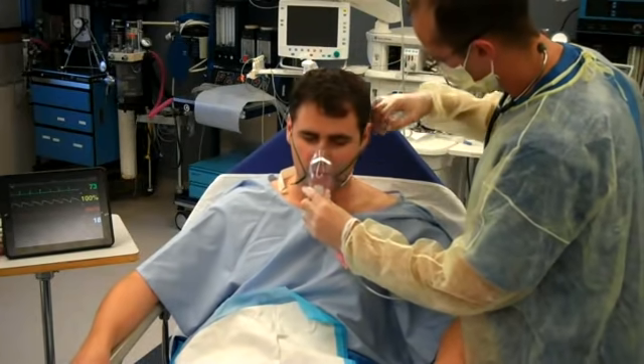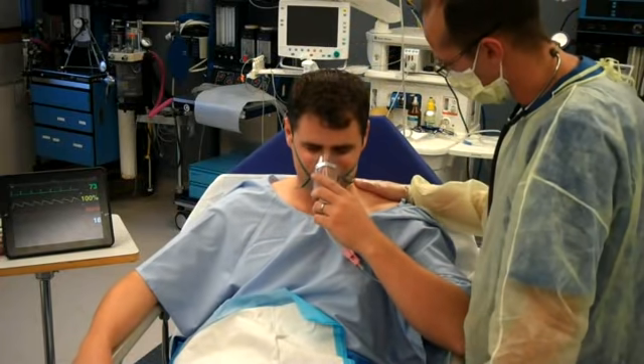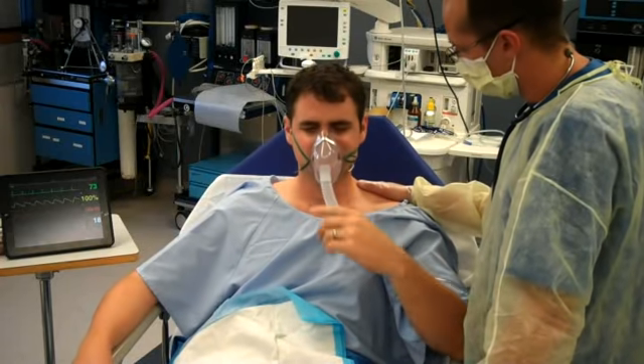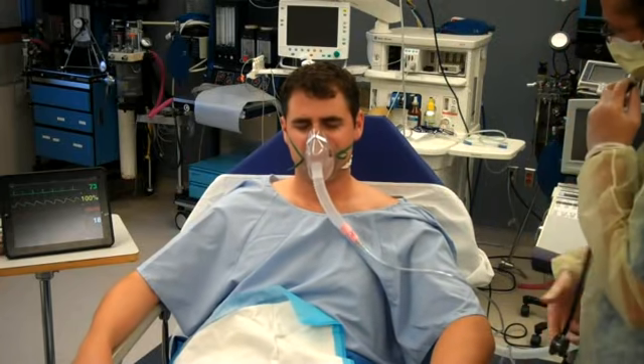Does that feel better? [Patient]: Water, please. Water. We'll get you some water in a sec, okay? So I'm going to get your breathing nice and well. Some nice breaths in. Your oxygen levels still look good. I'm just going to have another listen. [Patient]: I feel better.